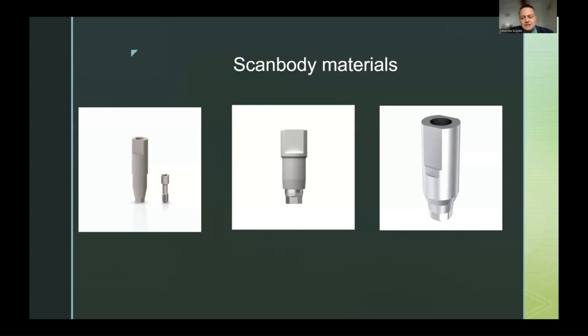On the right are fully metallic scanbodies. The middle coated scanbody is very easy to seat, torque, and scan, but after some time the coating will chip and the shiny metal underneath will be exposed, making scanning harder. When this happens, the recommendation is to replace those scanbodies. The fully metal ones on the right are the least prone to modification over time, but they are very shiny and hard to scan. Some clinicians spray them to reduce reflectivity, but this induces volumetric modifications and is not a correct technique.